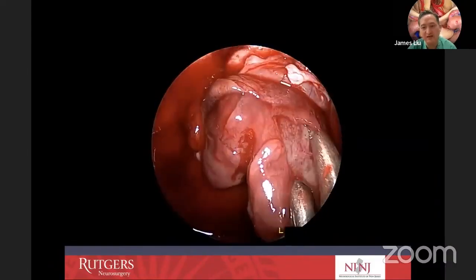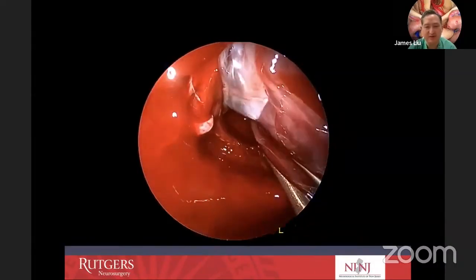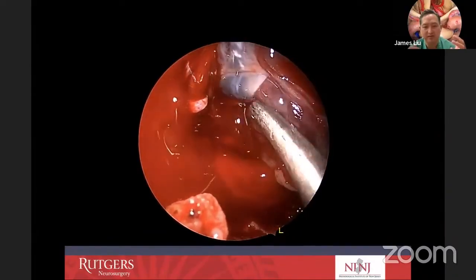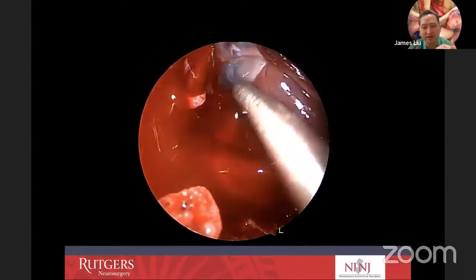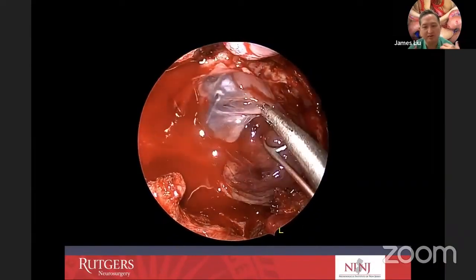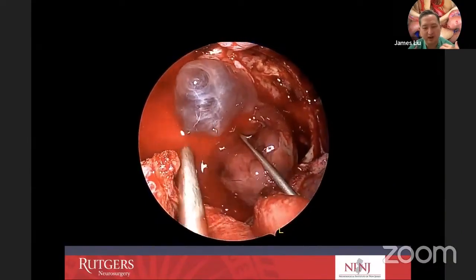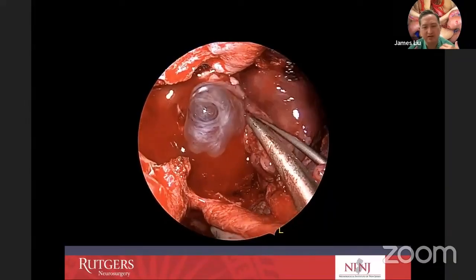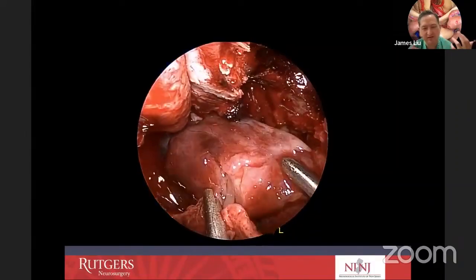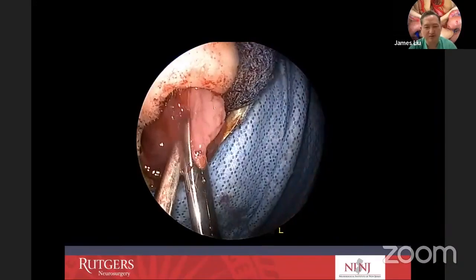And you do it in a very incremental fashion. Be very patient. Don't try to pull too early, but here's the arachnoid barrier. Here, the barrier looks largely purely arachnoid membrane, but you can see how I'm using a suction swiping technique and then just coming around the periphery. You want to make sure your suction is on very gentle power and then just gently sweep that barrier, that interface. And you can see now I've delivered that posterior component of the tumor.